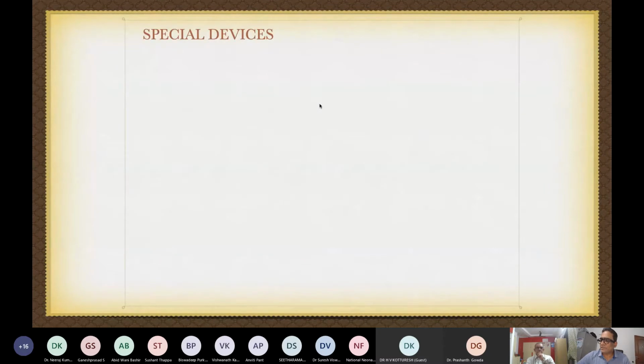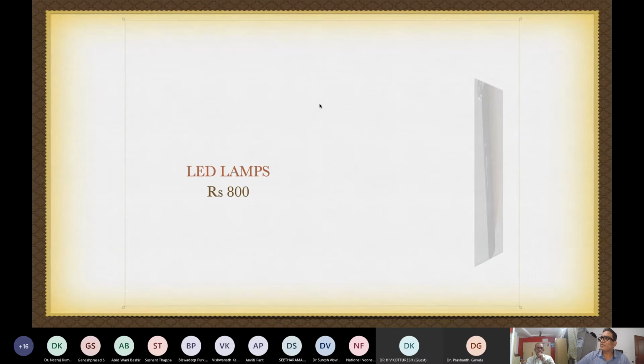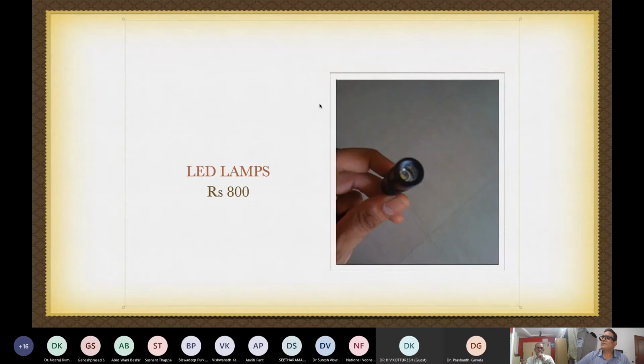But there are special devices. The problem with these devices is it may be difficult to clean because the light source is slightly bit deeper, and risk of infection is there, and also they are all not medically manufactured, so there is still a possibility of burn if you use it for longer period on the skin, and they are not FDA approved and all those things.